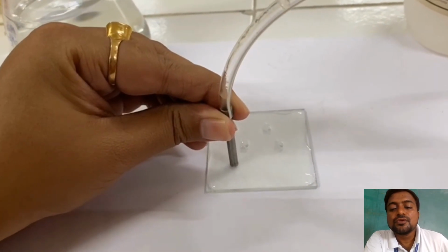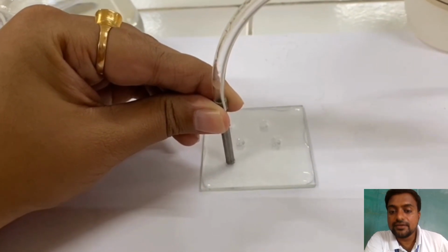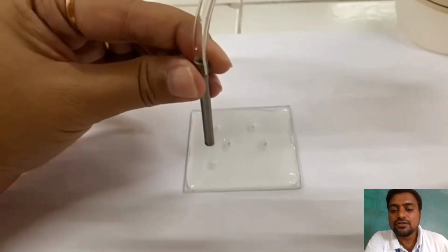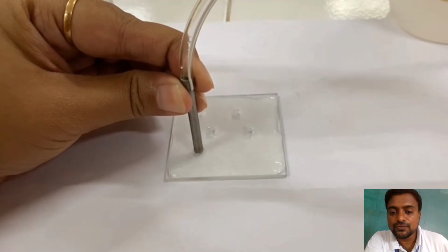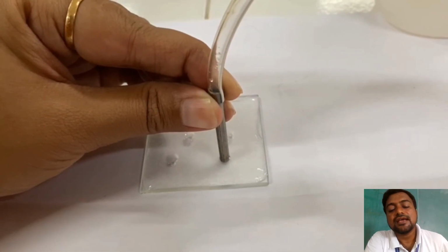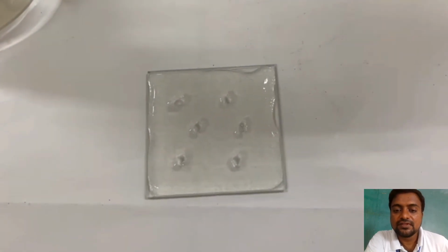So we now have a gel containing the antibody, and the gel has numerous wells cut out, as can be seen from this video. We can mark these wells as A, B, C or D for our reference and observations.